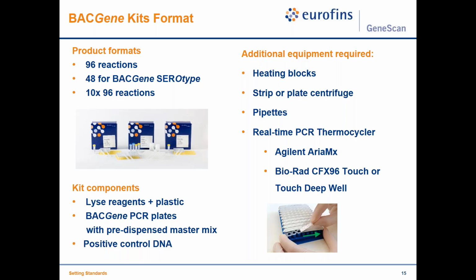Additional equipment is not a lot really that you need. You would need heating blocks for the lysis. There is a requirement for short centrifugation of the strips. So you would need a small lab centrifuge, pipettes, and then the thermocycler.